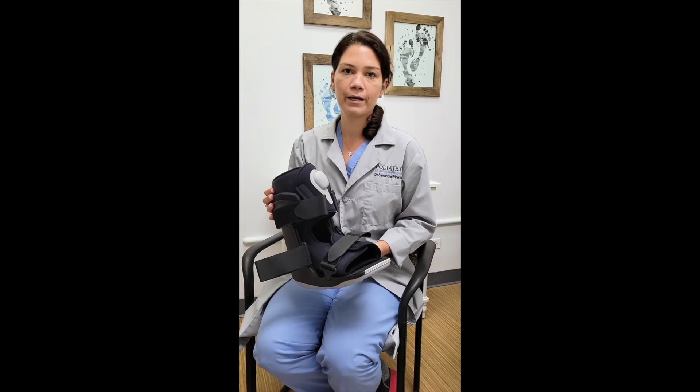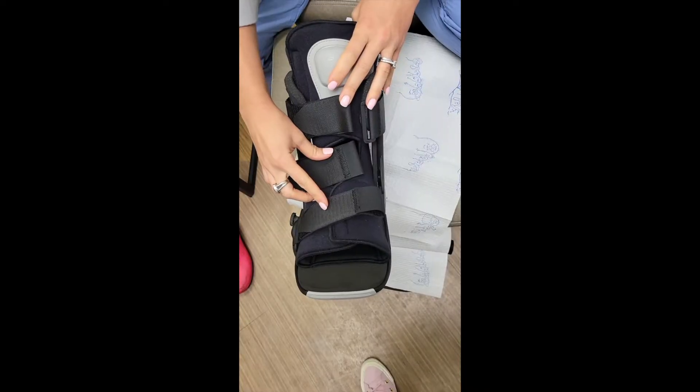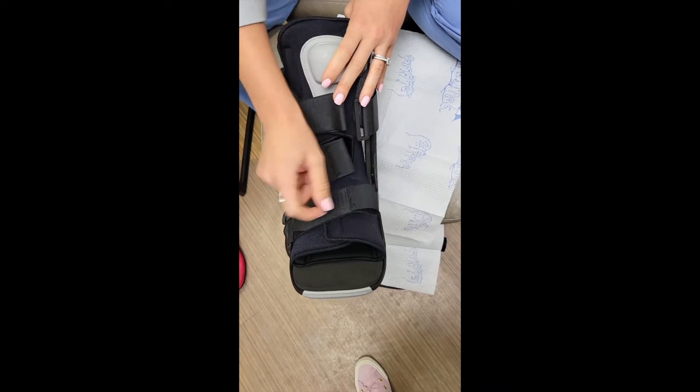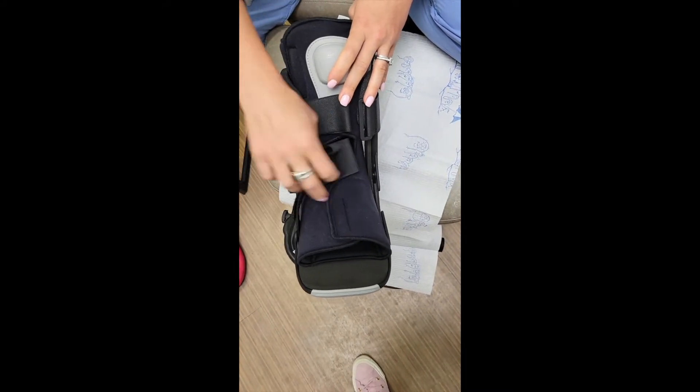I'm going to show you how to put it on so that when you get home you know what you're supposed to be doing. The boot will come with all of these straps done. You're going to open them all and stick them to themselves so they don't get stuck together.